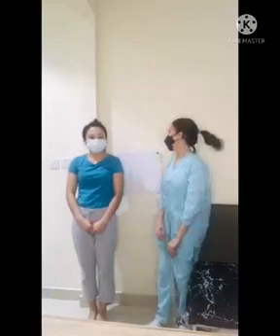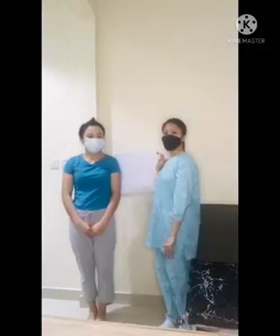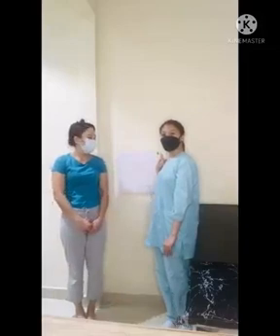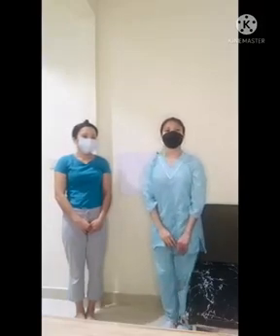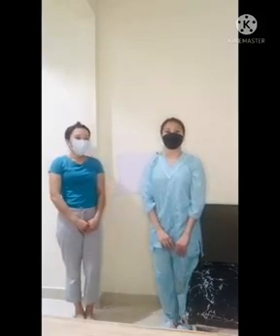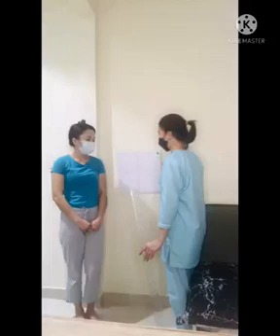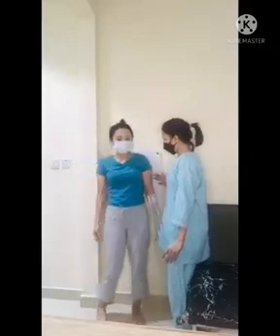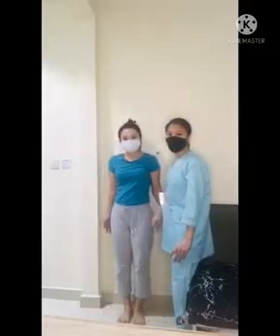So, the image receptor that we're going to use is an 8x10 image receptor for bilateral projection of our AC joint. The patient is upright. Adjust the center of the IR at the level of the AC joint, with the patient's arms hanging at the side.